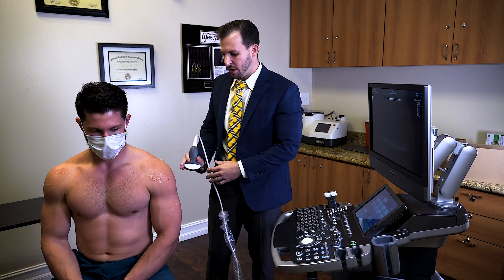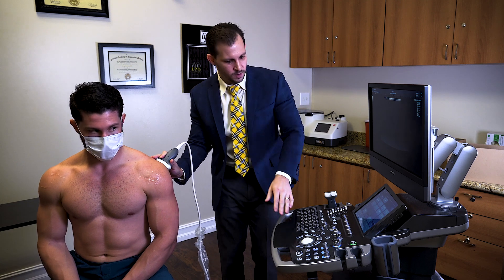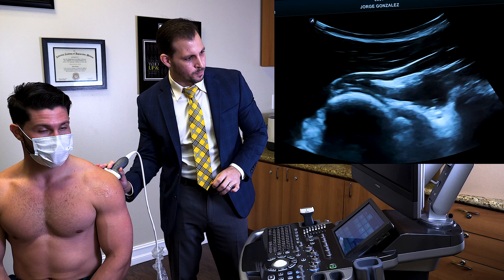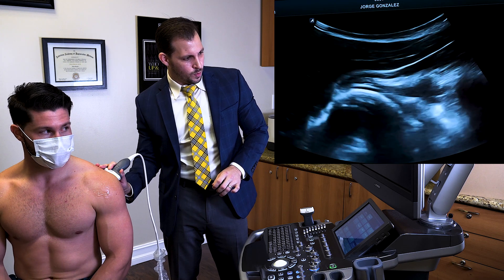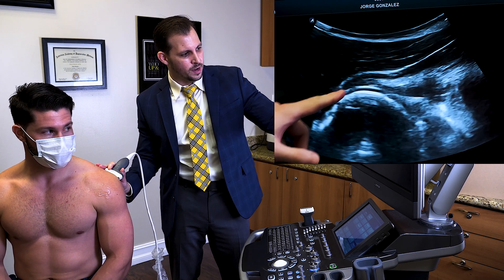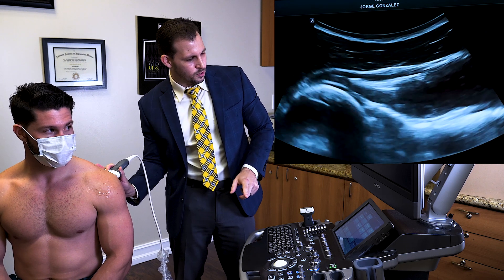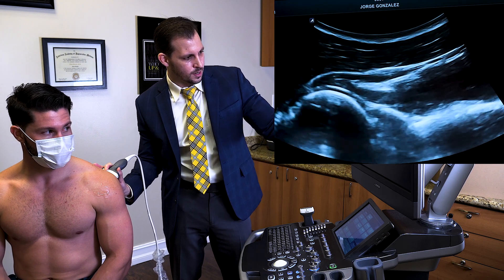What you want to do is approach from the posterior aspect. We are going to unfreeze my image, and at this point what we want to find is the humeral head. I'm going to make sure my image is a little bit nicer.